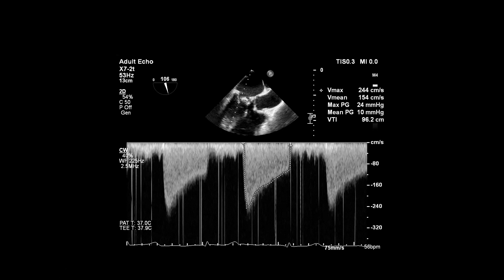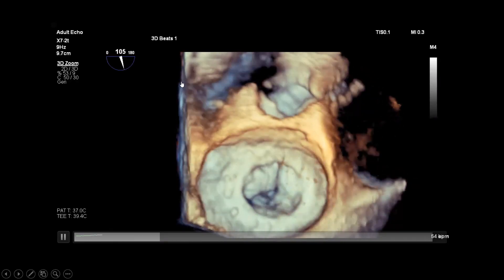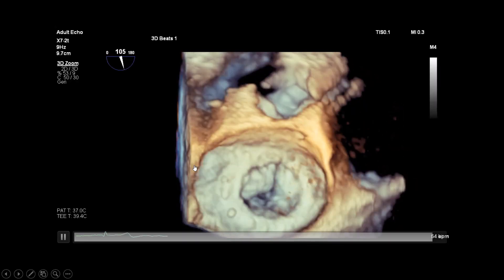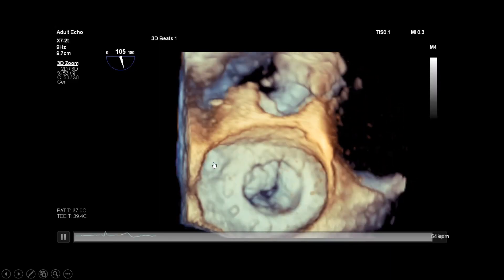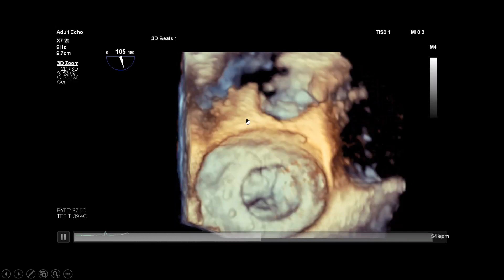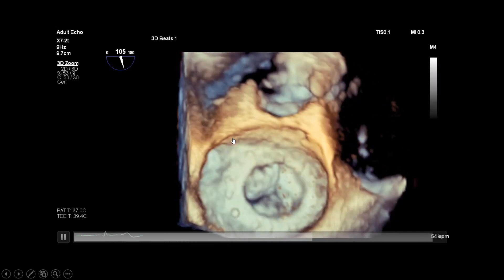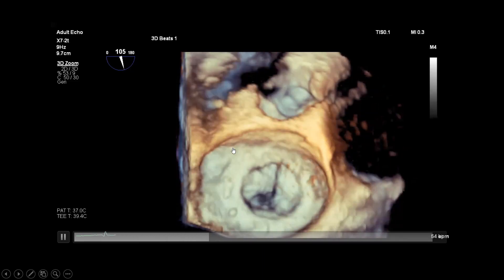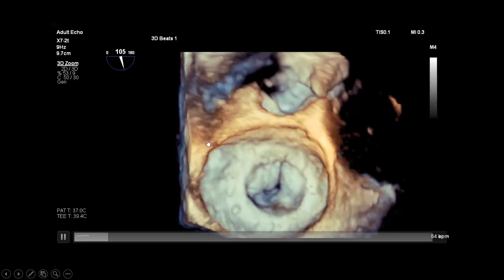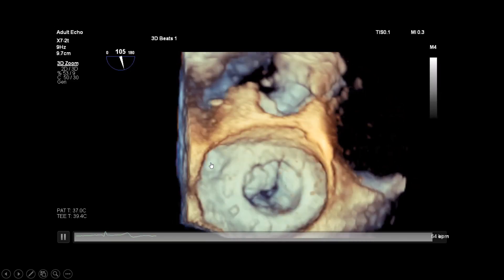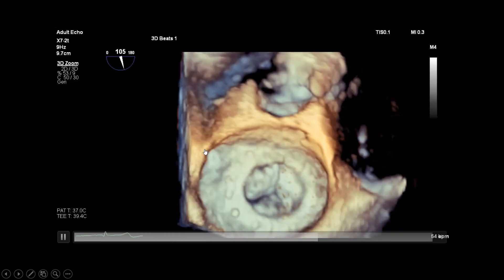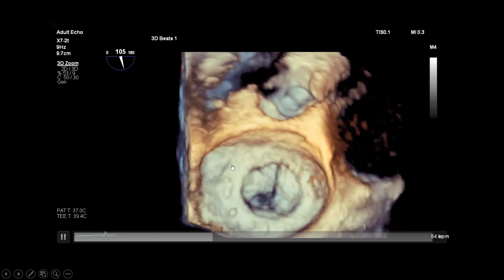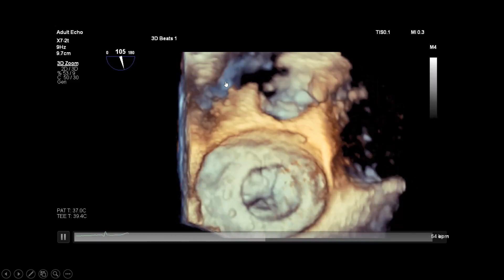This is a 3D TEE of the mitral bioprosthesis from the left atrial aspect. Looking now from the left atrium, these are the three cusps of the bioprosthesis, and this is the prosthetic ring. Everybody can appreciate how fixed and restricted these cusps are — the opening is very tiny, with only slight opening of the posteriorly located cusp. These are prosthetic cusps and cannot be named individually. The aortic valve is more or less at the 12 o'clock position.